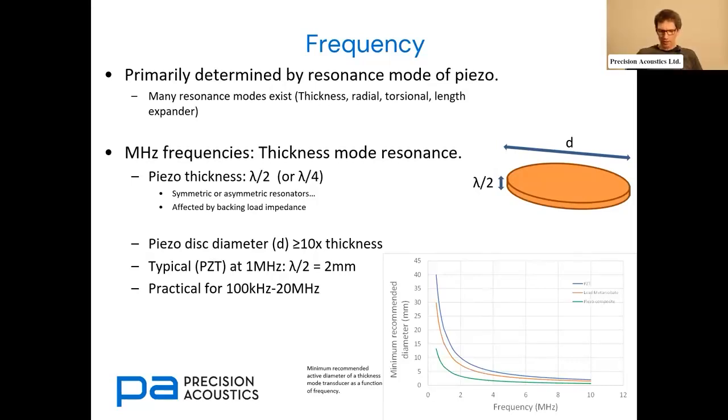Yeah, I think so. Of course, it's clear how you have the influence on capacitance through the diameter, but as you're saying, this PVDF film behaves in a special way, and the capacitance really affects the whole mode of operation, basically. Yeah, and you can look at the different films. You can look at thicker films and do the same comparison with diameter, and the thicker the film gets, the less it is affected by the capacitance, or the less the frequency shifts as a function of area. Purely a thicker film with a lower capacitance.